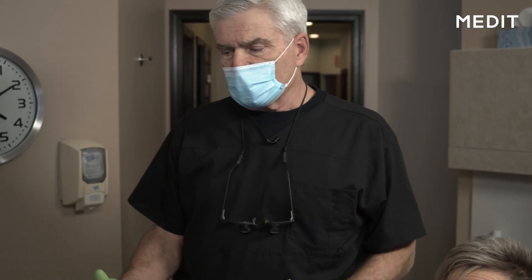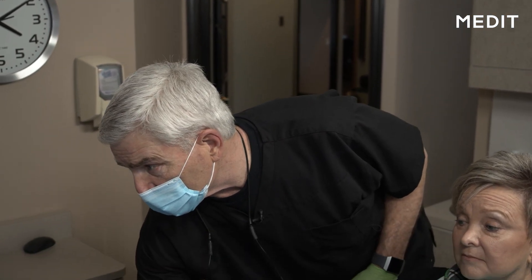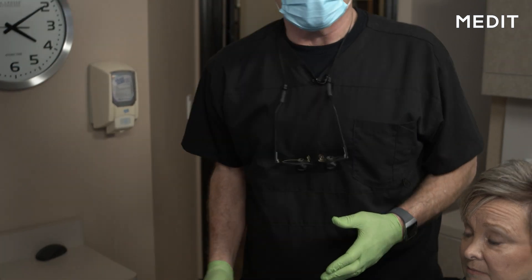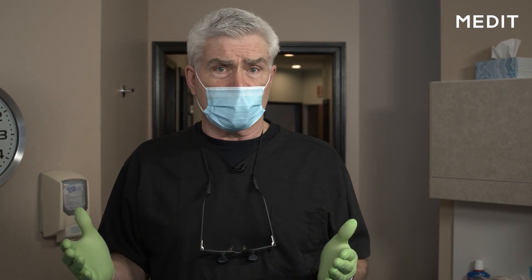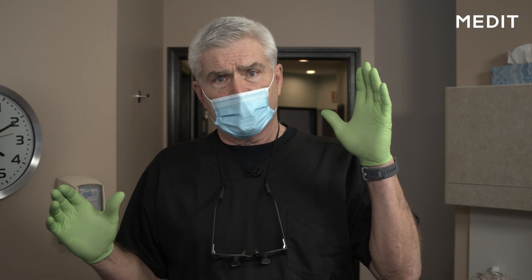Now that we've got it at this stage — the base models are built — we simply come over here to order. When we click on this it opens up the ordering capability, and since you've already partnered with your device manufacturer, I'd be sending this case off to Persomnus for manufacturing. It'll hit the internet and be there within seconds. We have an online prescription form that we use with Persomnus Sleep Technologies or your device manufacturer, and you'll send that off at the same time. The file itself and the prescription information will both arrive digitally within seconds — saves you a couple of days of production time and gets the patient into treatment faster.